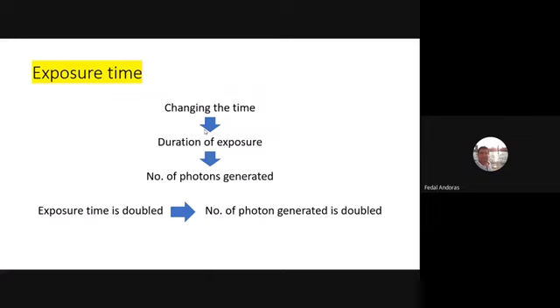So again, it's like mA. That's why I don't like to talk about the relation between mA and time, because you have a product called mAs. You might come across this if you read the textbooks, but for dental radiography, for your lessons this year, it's not required because it's more advanced, related to CBCT and others. But I just want to tell you that we have a product called mAs. It's a combination of milliampere and time.